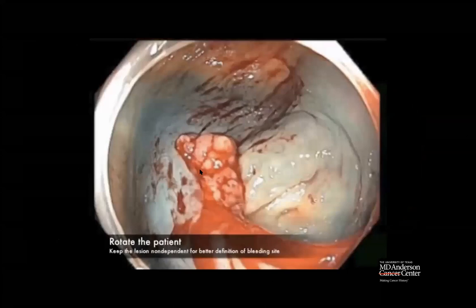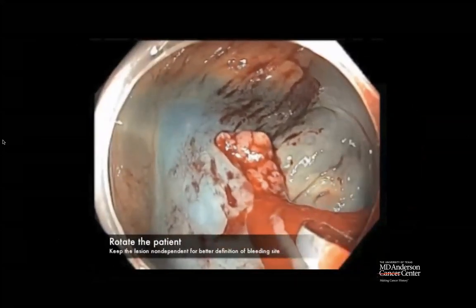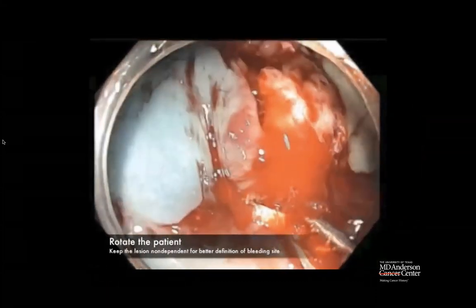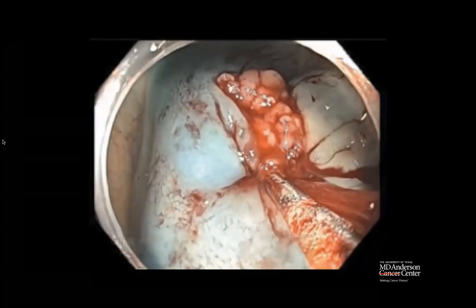All right. So we rotated the patient, and as you could see here, you could see the bleeding coming from the top end. And although we couldn't see the vessel, we thought that that's the bleeding part. And we applied the clip, or closed the clip.